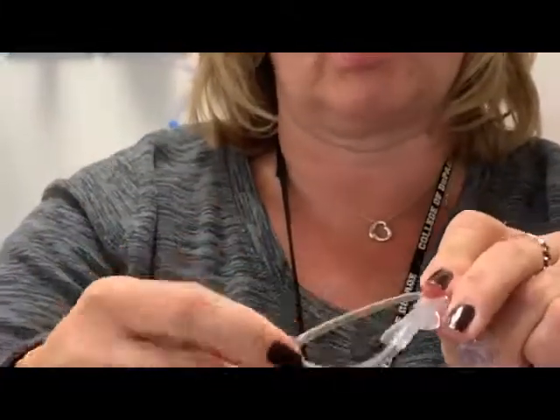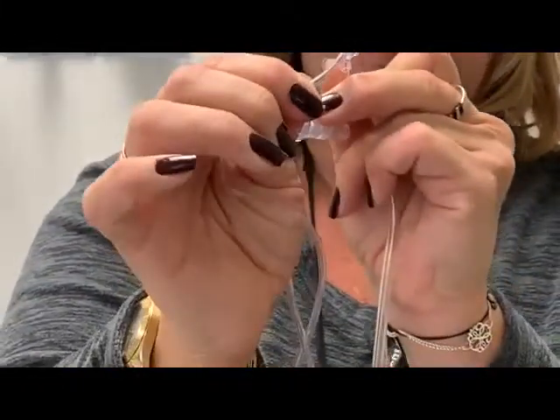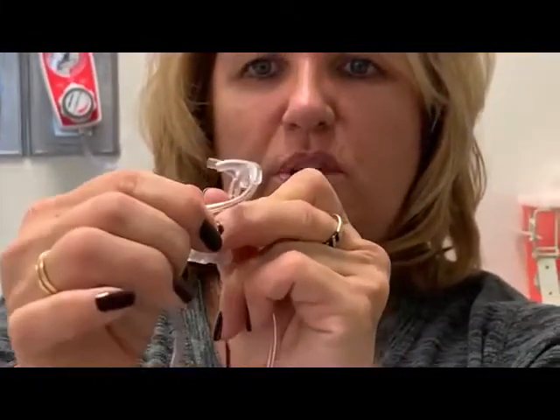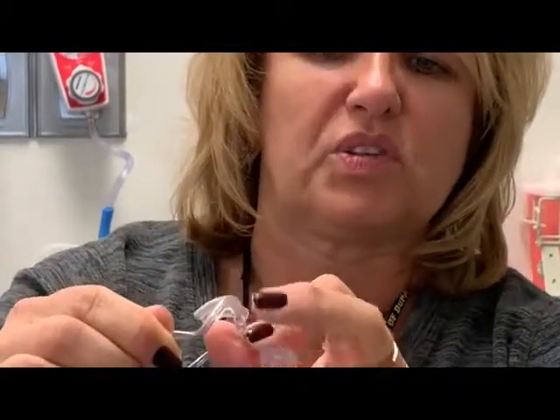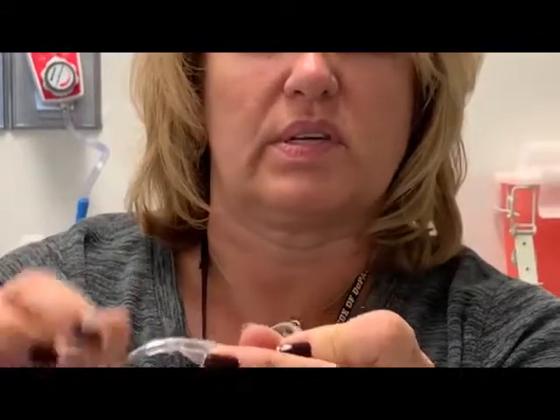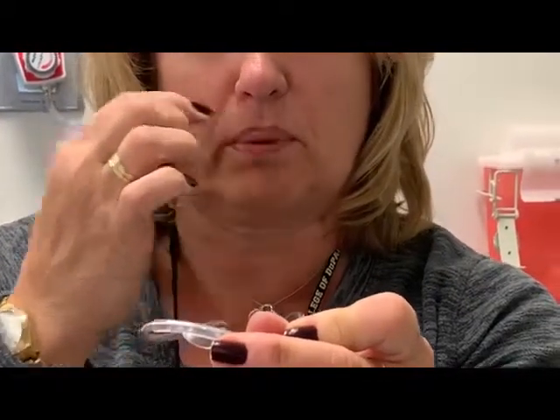You also want to make sure that you're following the natural path of the nose. So your application is going to be just like this as it goes into the patient's nose. Some of them will also have a little stand here that helps you know that it's going to stand right here on the upper lip. Nasal cannulas can run anywhere from 1/4 liter up to as high as 6 to 8 liters, depending on what you're reading or what your hospital is doing. Most hospitals are going to transition to a different device at about 6 liters.